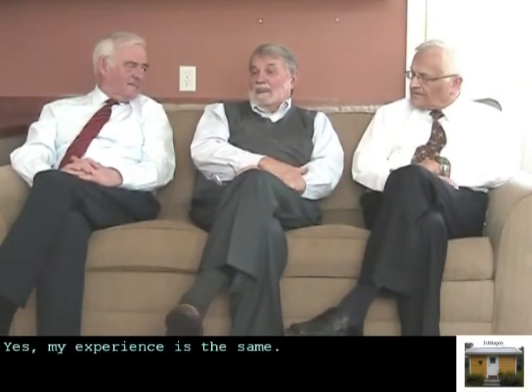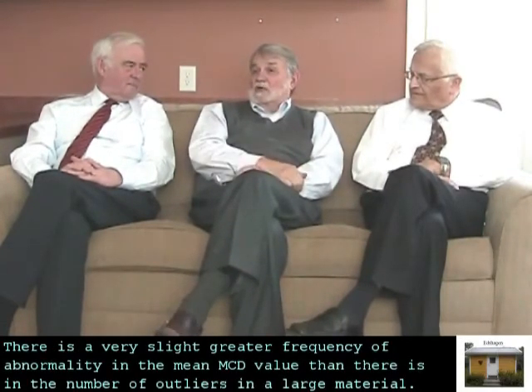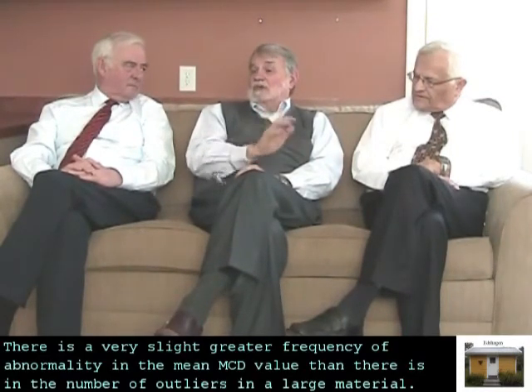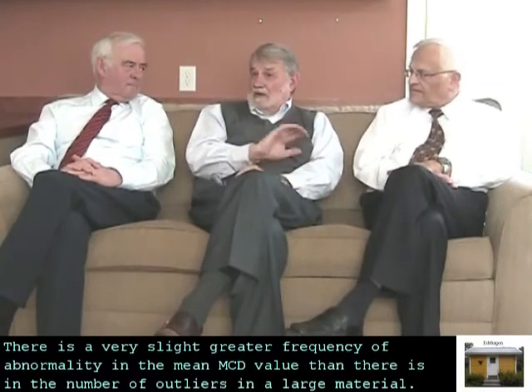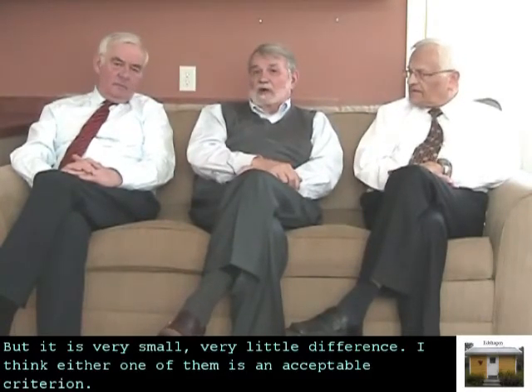Yes, my experience is the same. There is a very slight greater frequency of abnormality in the mean MCD value than there is in the number of outliers in a large material, but it's very small, very little difference. I think either one of them is an acceptable criterion.